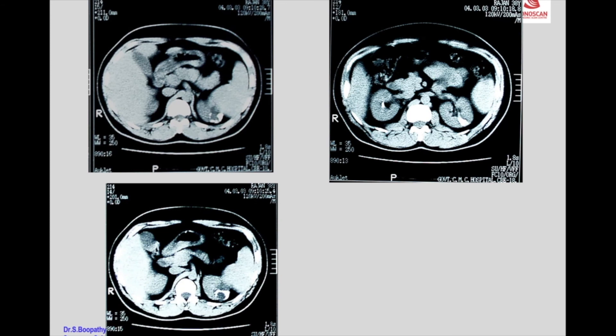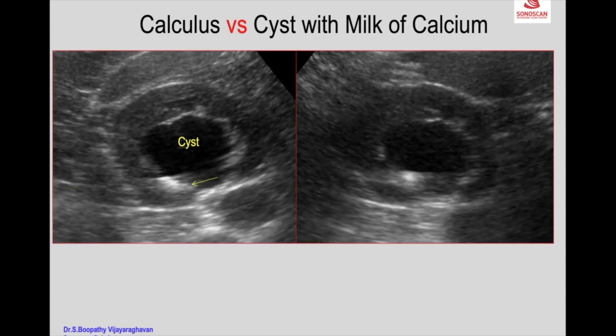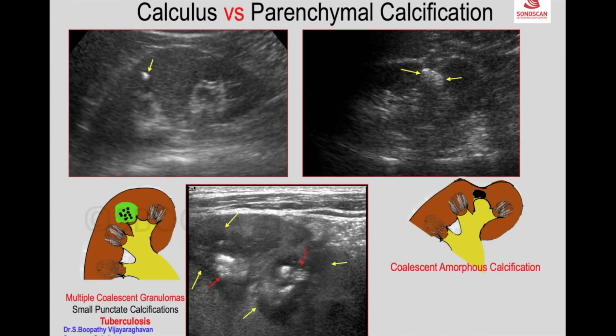This is the calcification, and that is the CT scan done after the IVP, reported as a calcified mass. But the cyst with calcification in axial scan supine, versus axial scan in prone, also shows a mass of calcification.